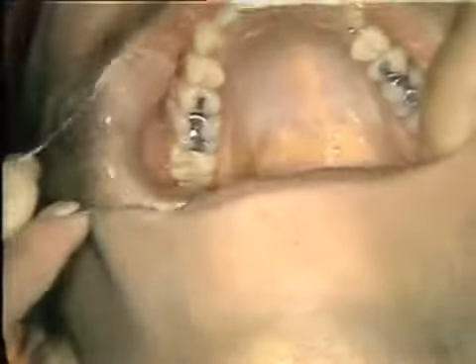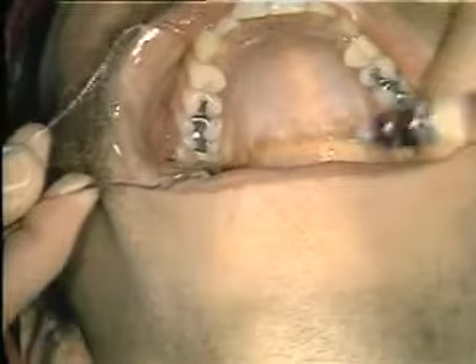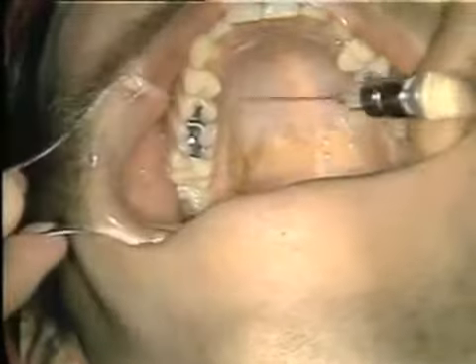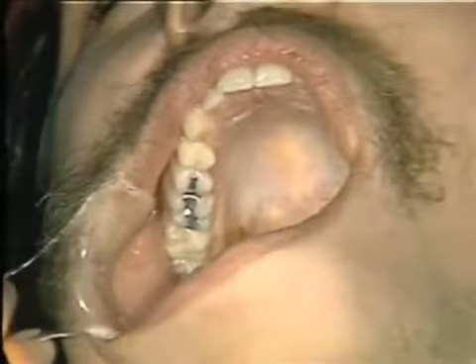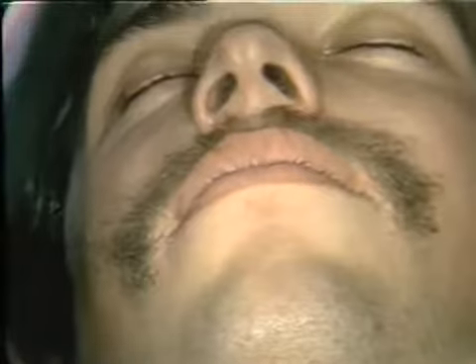And once again, this will anesthetize all of the palatal soft tissues from third molar up to approximately the cuspid area where it anastomoses with the nasopalatine nerve. We'll let you close for just a moment, Andy. Now, once again, if we were just involved with one tooth or the instrumentation upon palatal tissues associated with one maxillary tooth, it wouldn't be necessary to block the entire anterior palatine nerve. Let us suppose we were going to remove the maxillary first bicuspid.